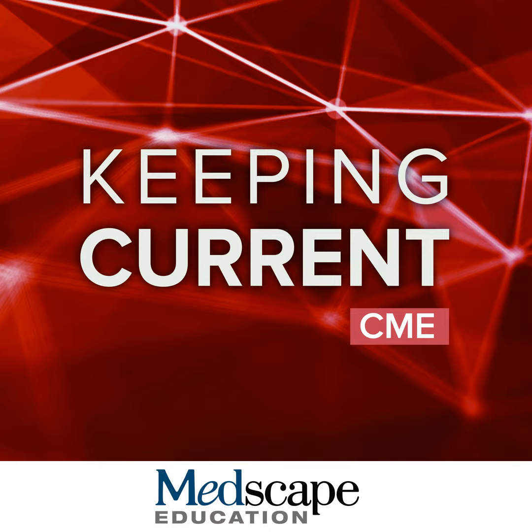I just want to provide you a possible solution. This was based on a review paper published actually this year by Singal, and I was actually part of this, where if you look at the LI-RADS 3 lesion, it's really important to look at the size. If the size is small, you can really continue follow-up every 6 months.